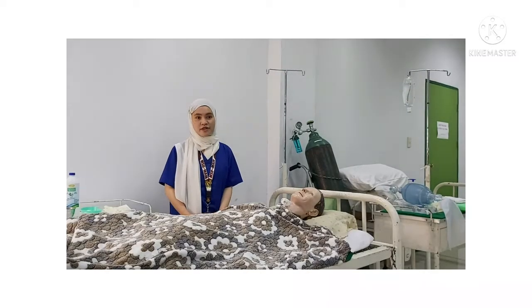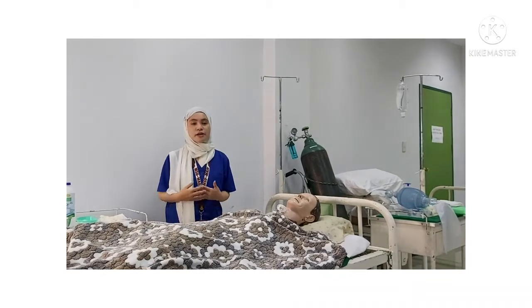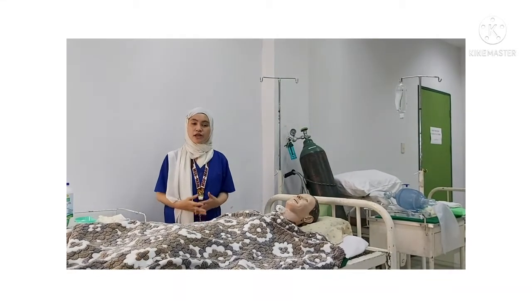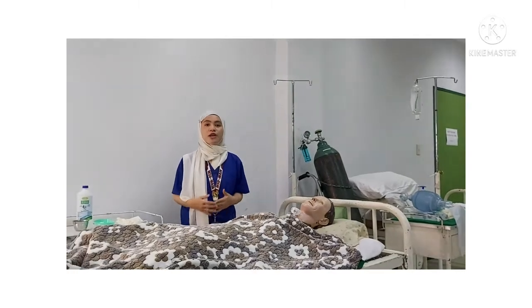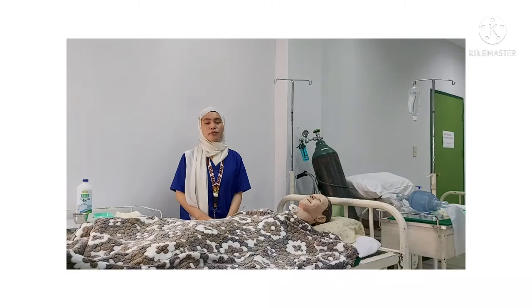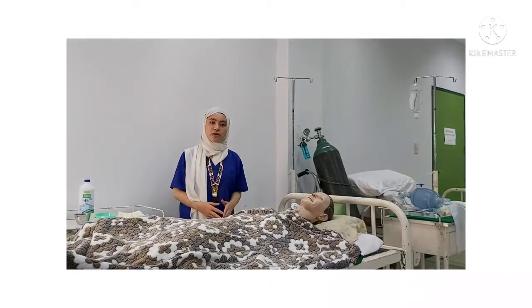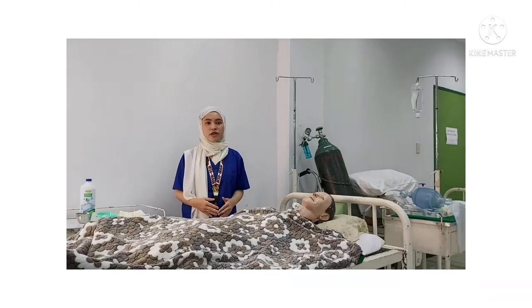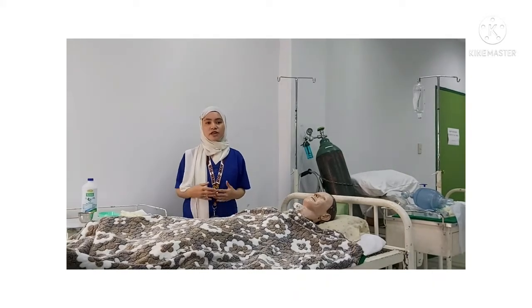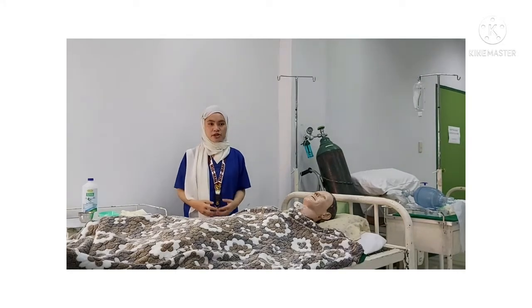Airway suctioning. Definition: it is a procedure that is done in a healthcare setting, including acute, subacute, long-term, and home settings. The purpose of this procedure is to remove secretions from the respiratory tract that obstruct the airway, to prevent infections that may result from accumulated secretions.